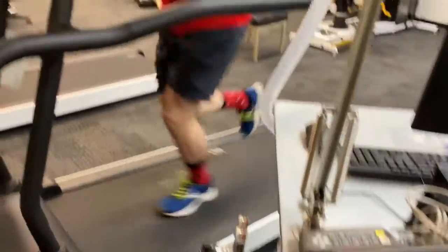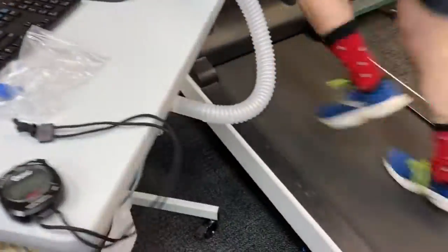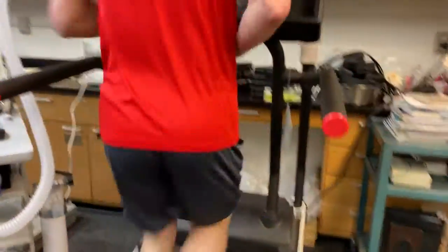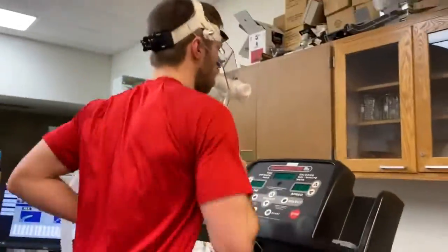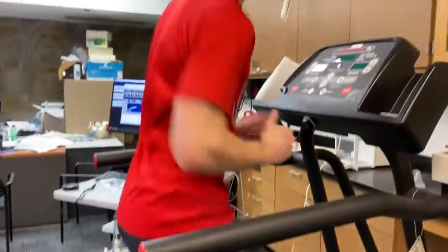Just about three graphs. Just trying to give you all a couple of different ways of looking at this. There's a face mask that's put on right there. You have to be relatively close to the person to try to make sure that they stay on track.